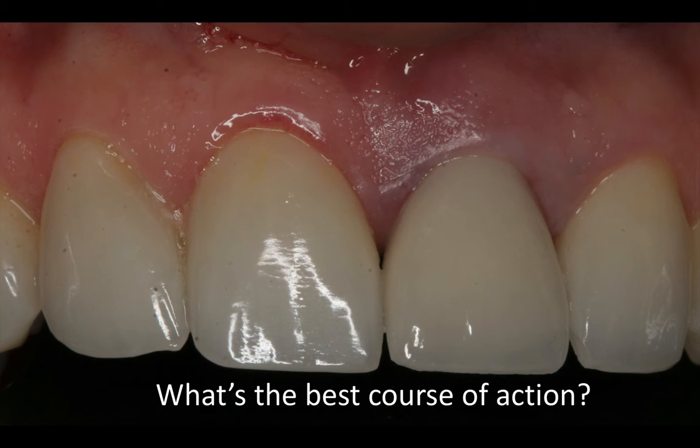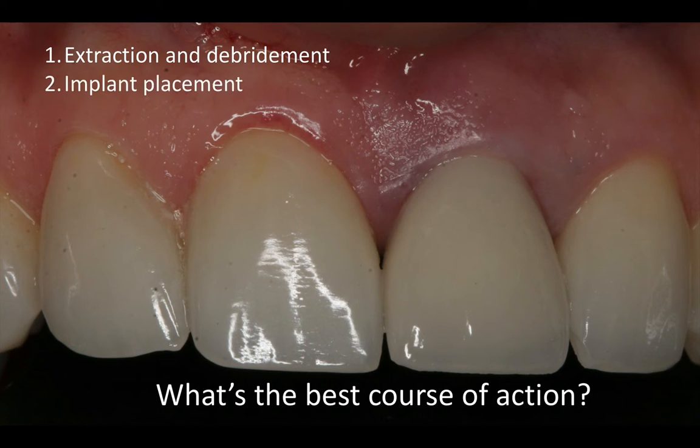Try not to be dogmatic and treat every case the same. What I do, I define the goals of what this patient needs. This patient needs to have tooth number 9 extracted and the infection debrided and cleaned out. That's really goal number 1, and it's very achievable. Goal number 2 is to place an implant, and for that purpose, we need to rebuild the site with bone. We know there's going to be some bone deficiency. And we need to place a provisional. Whether we're placing an immediate implant or a delayed placement, we need to arrange for some type of provisional for obvious reasons.